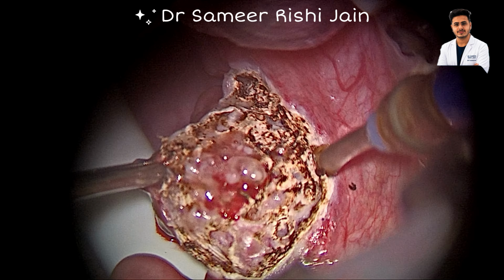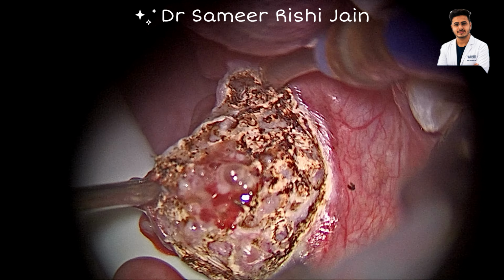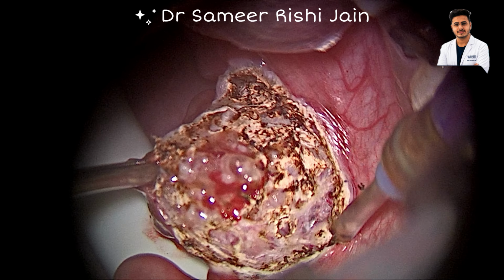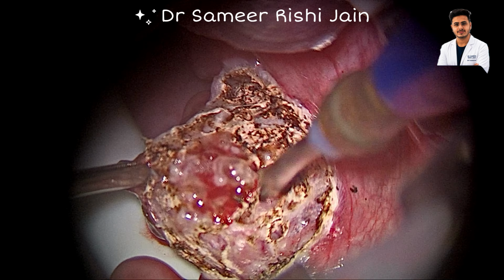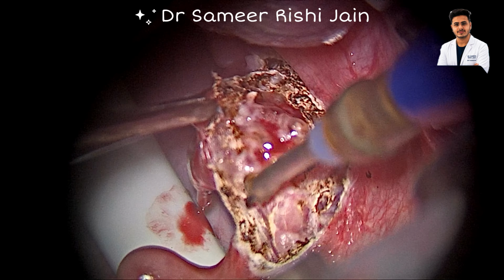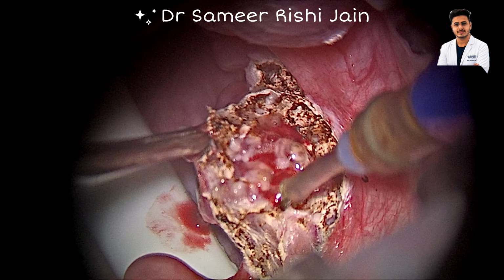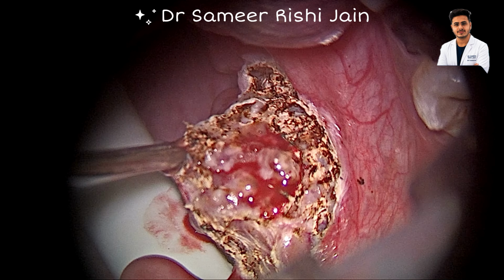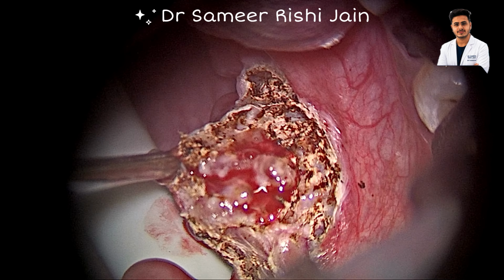As you can see, I am able to find the plane in the lateral part. We can use the monopolar cautery to push the bed a little laterally. We have to find the correct plane at the start of dissection so that our dissection does not get compromised in the further part of the surgery.